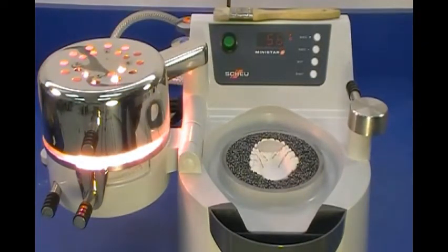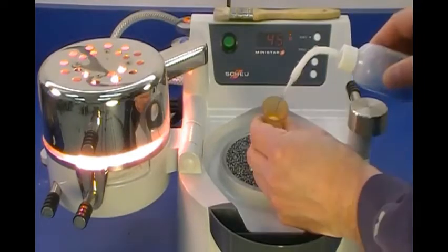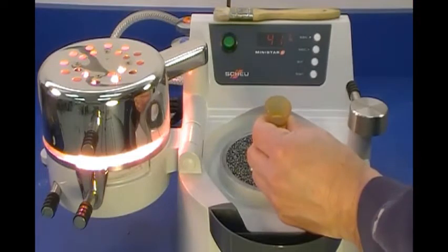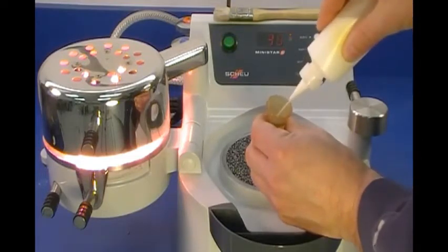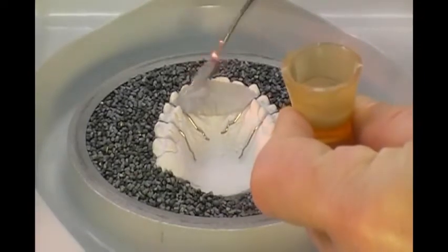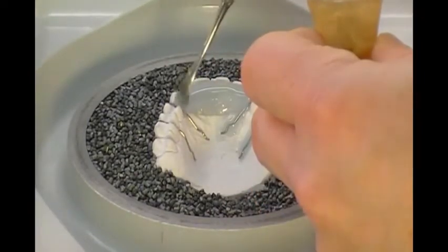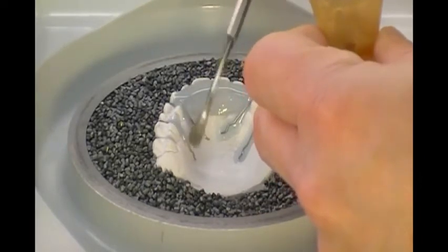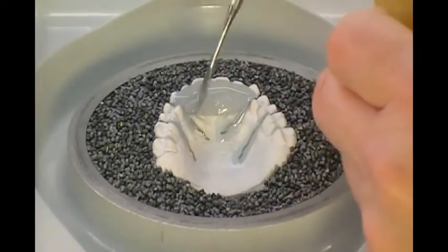With 45 seconds remaining in the heating cycle, mix monomer liquid and polymer powder to a maple syrup consistency with a No. 7 spatula. With approximately 20 to 30 seconds remaining in the heating cycle, apply resin over bite plate acrylic and retainer wires.